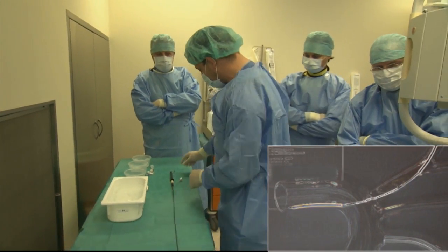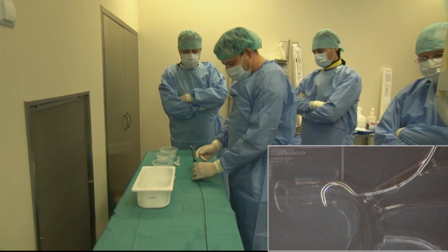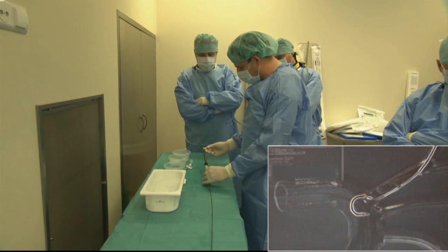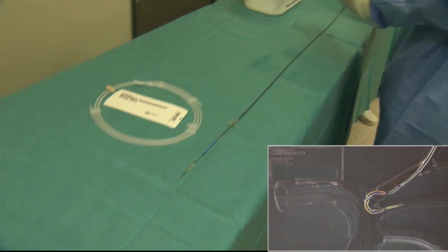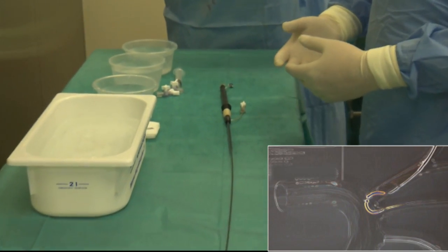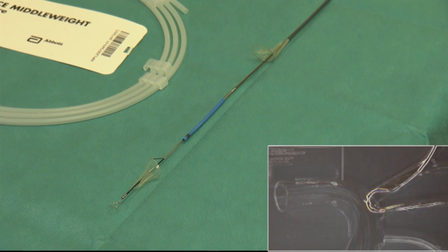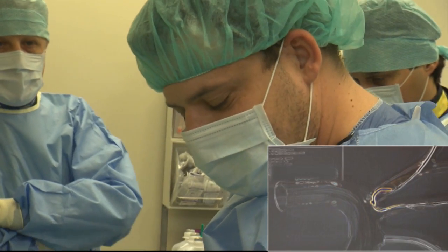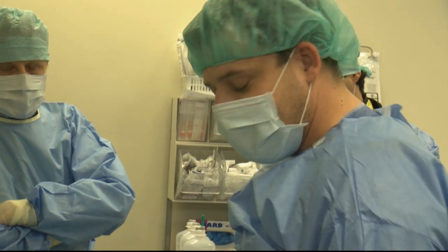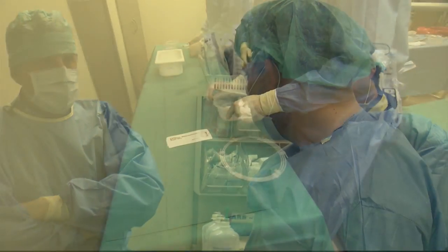So here right now there are several ports. One is for flushing the distal filter here. This here is for flushing the proximal filter, and this one is just to flush the articulating blue part of the catheter. The idea is to put this prior to any endovascular procedure on the aorta, and this time it's TAVI. Then perform the TAVI procedure, and after that we will retract both filters into the catheter again, and we'll take the whole system out, and then we might have a look at what we captured.